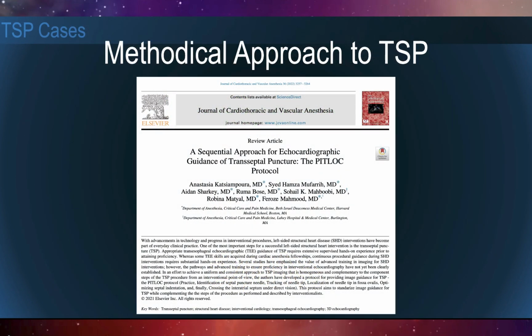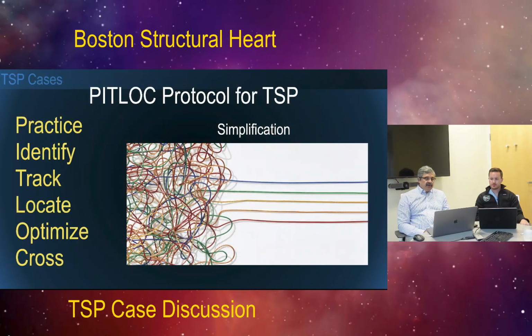And that brings us to the PITLOC protocol that you are actually a co-author in. That's the one that we follow for our Trans-Septal Puncture, which is a methodical approach towards training, which I'm sure somebody must have gone through in the workshop as well. So this is based on simplification, and PITLOC stands for practice, identify, track, locate, optimize, and then cross. And each one of these steps has a value and a very specific process that it goes through.